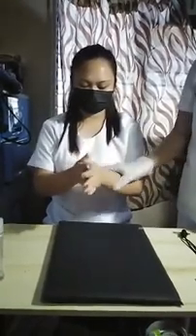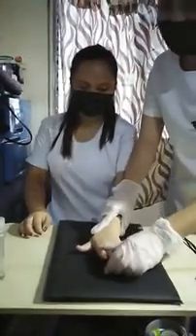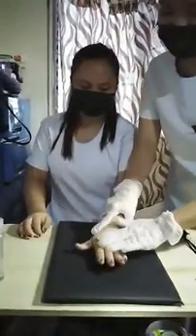Next we have the Gaynor-Hart method, carpal tunnel in tangential projection. Patient position, seated sideways at the end of the table. Place arm on the table with elbow bent. Ideally, upper arm, elbow and forearm are all resting on the table.